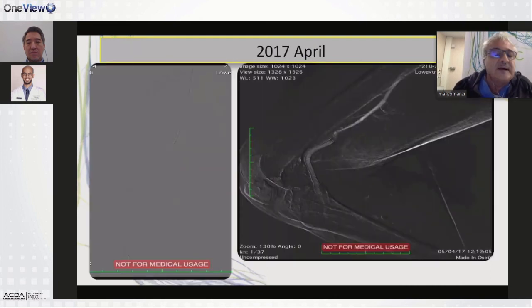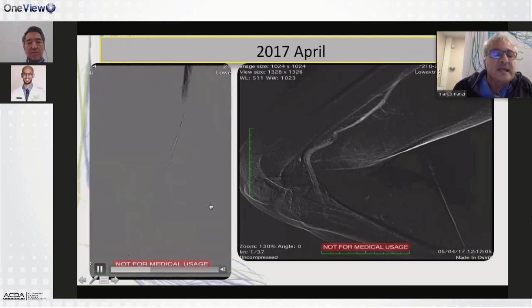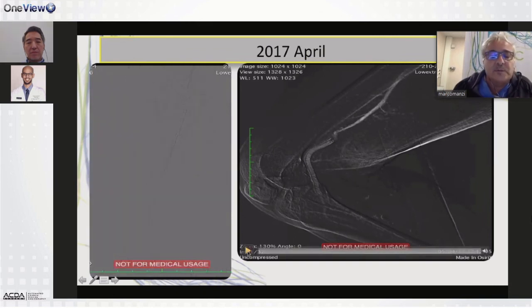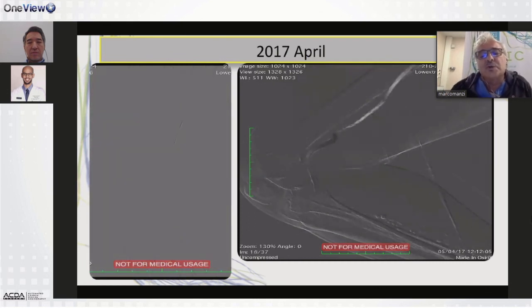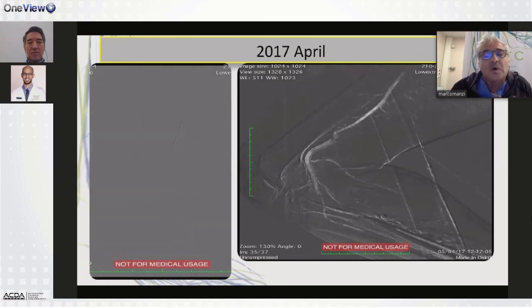And you can see the imaging. After the Supera stent implantation, you can see the evaluation with another bolus of contrast medium, but you can see the flexion angiography with CO2 as well, with a direct injection and a very nice flow.